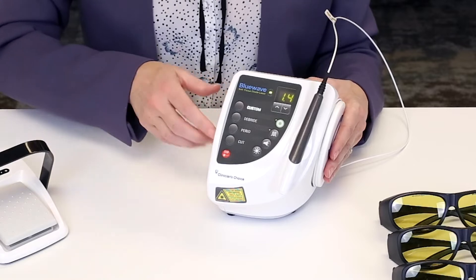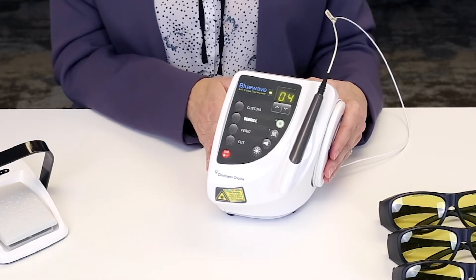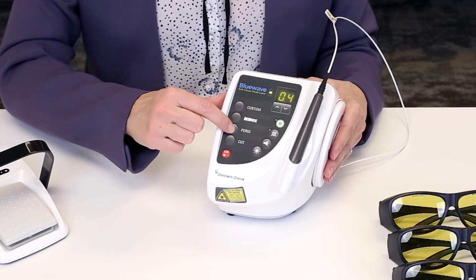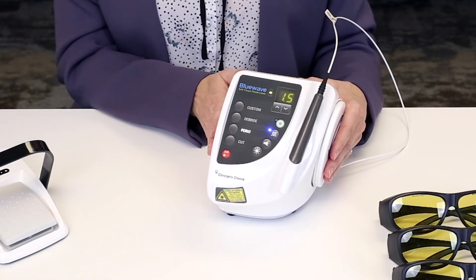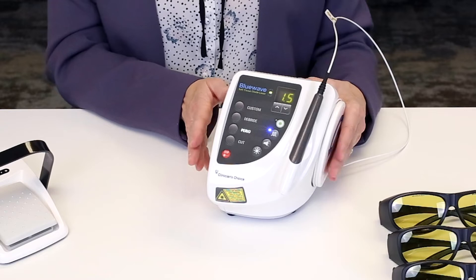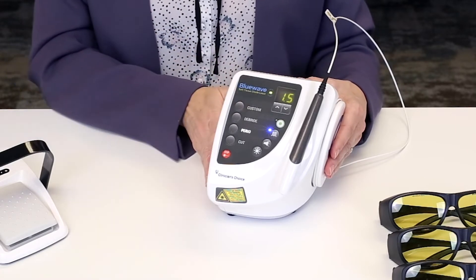The next preset is our Debride setting. You'll notice that the wattage changes on the unit. For any hygienists or anyone intending to use the BlueWave for hygiene, the perio setting is going to be a crucial function. You'll notice that a blue light turns on here, which simply indicates that the wave is now in pulse mode instead of continuous wave mode. Again, the wattage has changed.